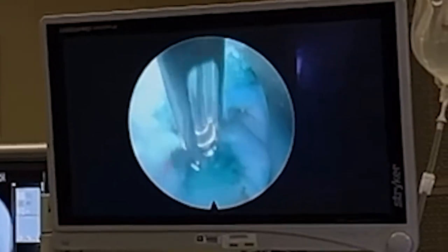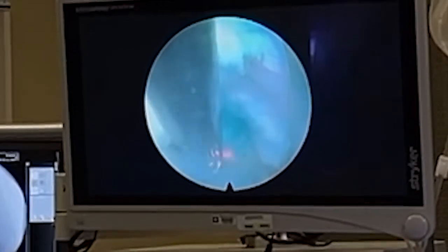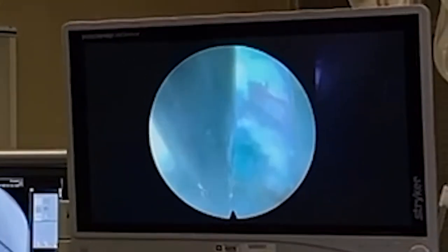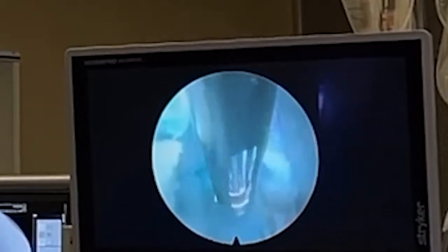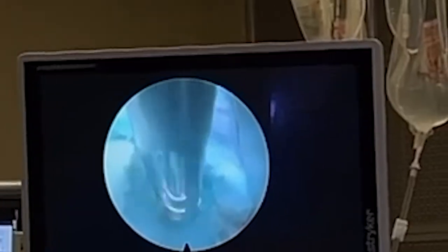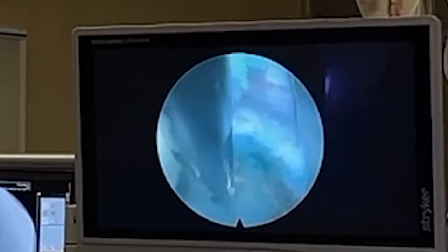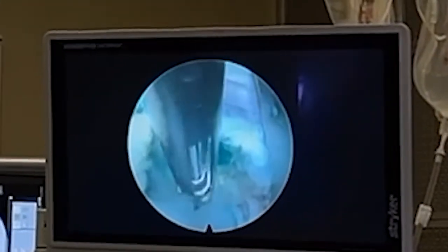Oh, I wish you guys could see this. This is the coolest thing in the whole wide world. I'm literally working right underneath the nerve. Because not only is the laser very precise, it's side firing because it can bounce off a mirror. But it doesn't remind me to blink. It's the only problem.